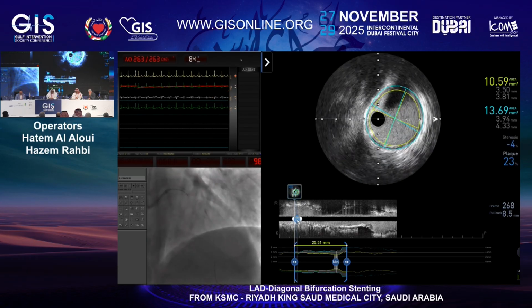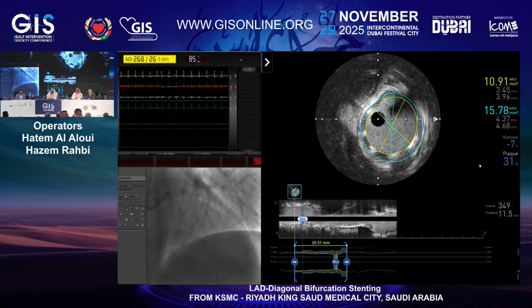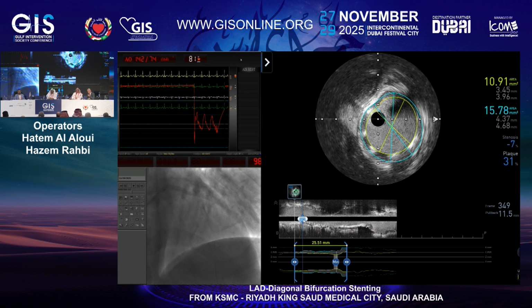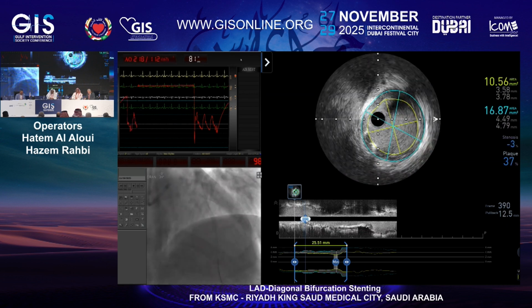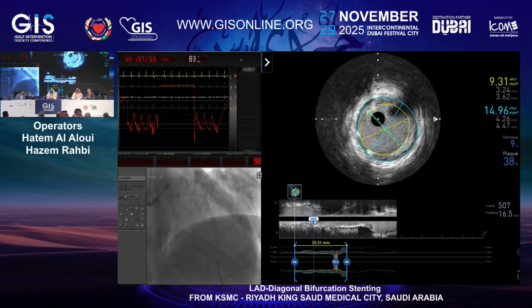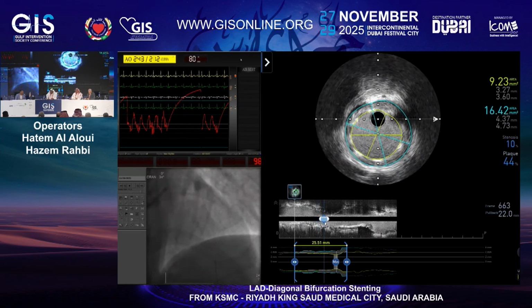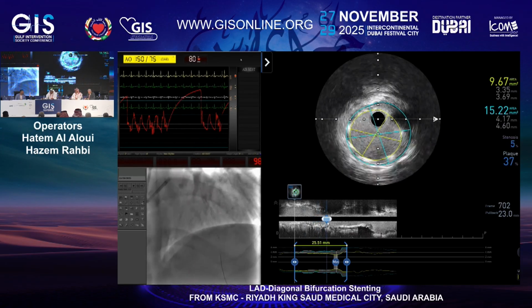You can see we are over 100% expanded distally compared to the distal reference. I like this new Avigo, it's nearly like OCT with AI technology.